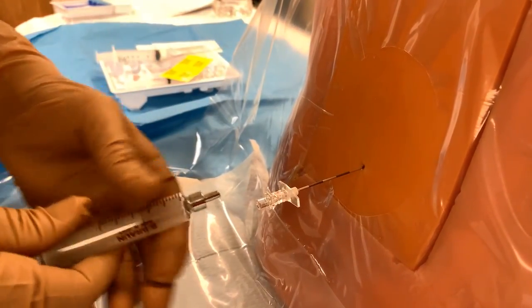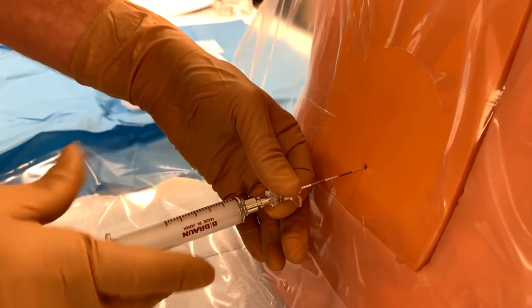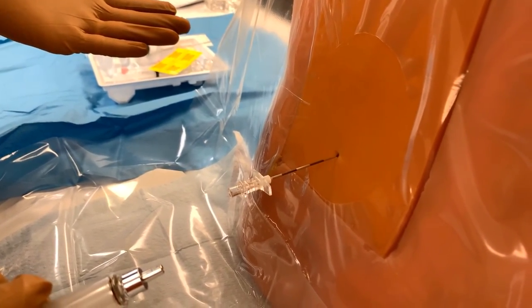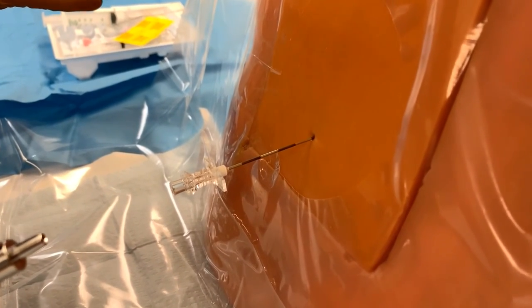We have good loss of resistance as we penetrate the ligamentum flavum and enter the epidural space. We'll disconnect and check one more time for loss of resistance — yes, good loss of resistance there. We'll check to make sure there is no free-flowing CSF indicating that we've entered the subarachnoid space by mistake.